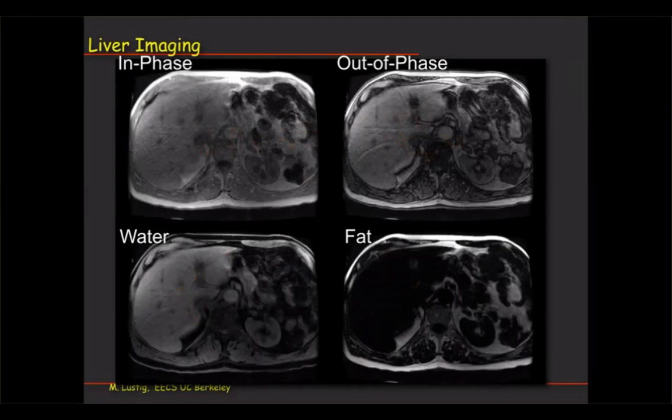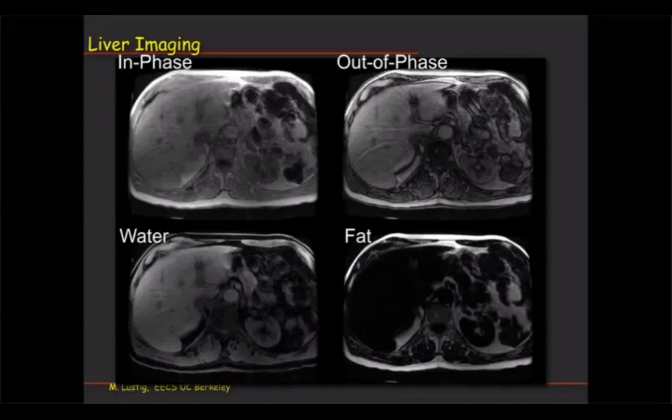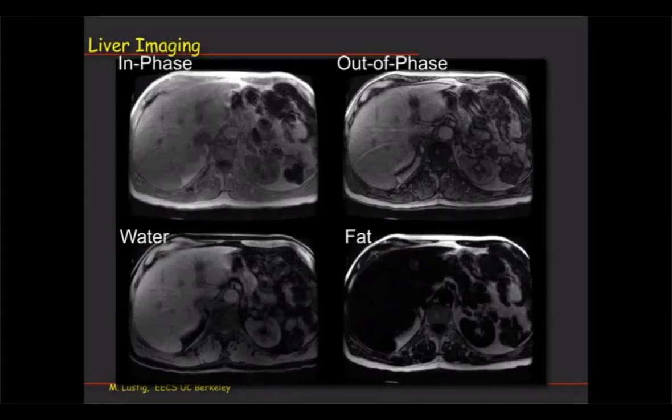That said, this is not exactly going to work out, because in addition to that, don't forget you have off resonance. So just adding and subtracting doesn't necessarily give you what you want. And so you have to correct for the field inhomogeneity in order to be able to do this. So often people acquire 3 echoes, not 2. Although now there are very successful imaging algorithms called 2-point Dixon, which basically use just 2 images. But you have to estimate the background field for that. Any questions?